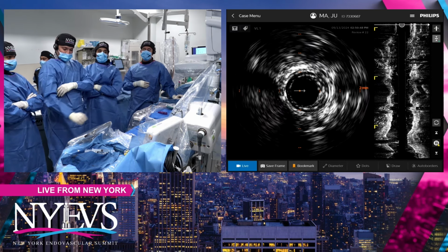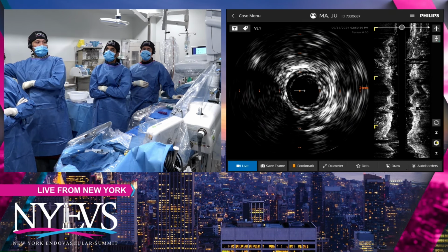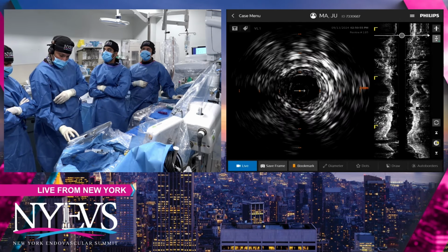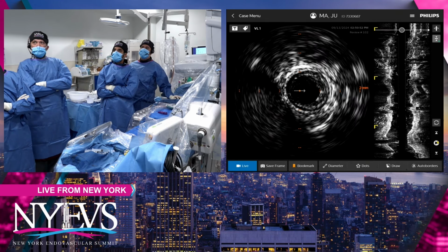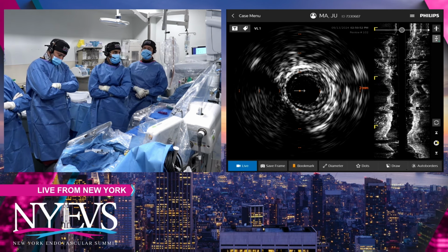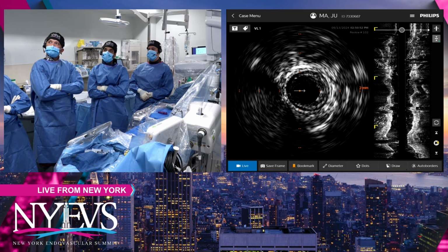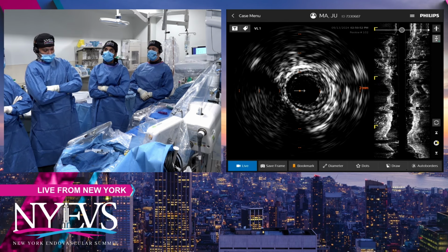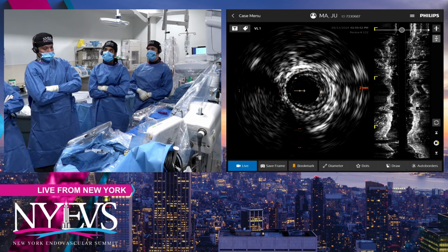Well, basically, in my institution, in-stent occlusion is treated in 100% of the cases with Rotarex. We are doing this since 2000, so 24 years now. Every year we are performing between 500 and 600 Rotarex procedures, so it's really a workhorse device. And I've never used a filter, to be honest, because if you are doing it carefully, if you advance the Rotarex step by step, I personally have not seen a distal embolization, in particular in in-stent reocclusion so far, in a couple of thousand cases. So it's not a real problem.